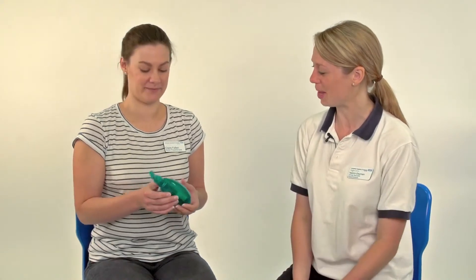So what I'd like you to have a go at is doing ten breaths. Pop it in your mouth, sitting nice and upright, shoulders right down and relax. Breathe in through the Acapella and then take a nice prolonged breath out — keep going — and relax. Your cheeks are nice and straight, because sometimes due to the oscillation you can make your cheeks wobble and scoop air into your mouth. We want to make sure that we're breathing right from the very bottom of our diaphragm so that you're clearing all the way down through the lungs.